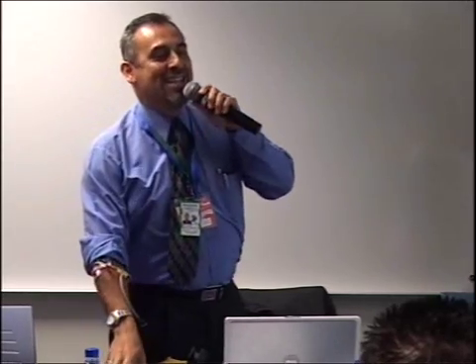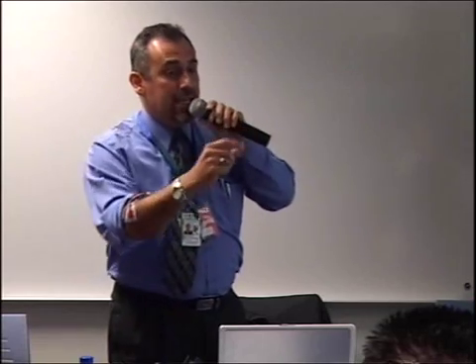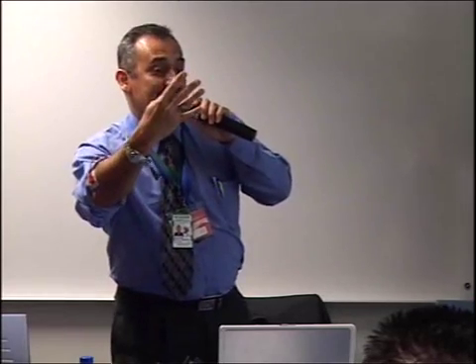I know the system is somewhat simplistic, but using other signal patterns requires more analysis. It is contemplated to do this in order to obtain other signals which can be used for wrist rotation or for some other movements.